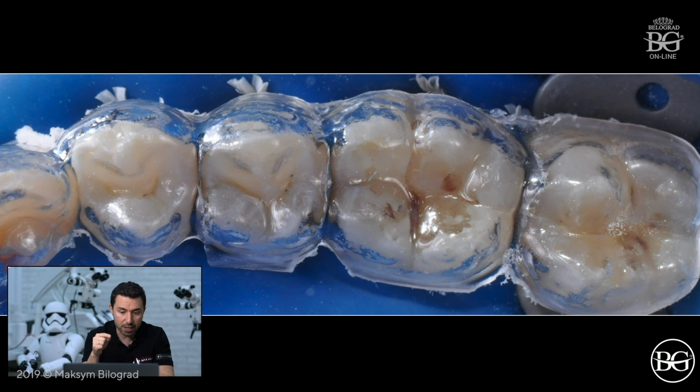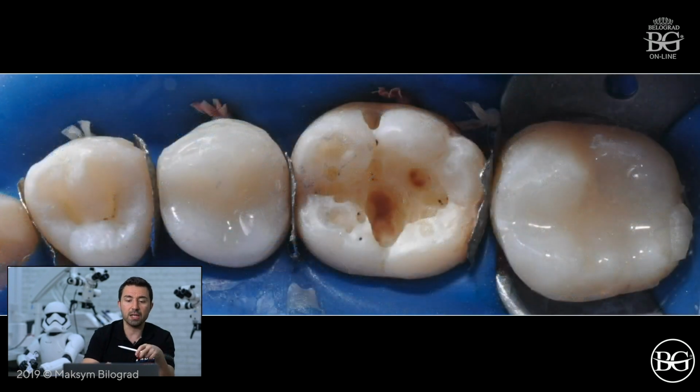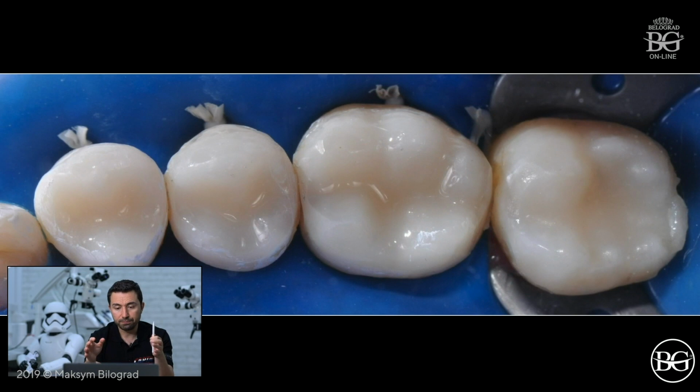And in this case, I didn't reline this rigid tray with a transparent silicone index, and you can see that after copy-paste the anatomy was not perfect. The main anatomy was done, because the thermoplastic material from the vacuum former is not super precise to give you reflection.